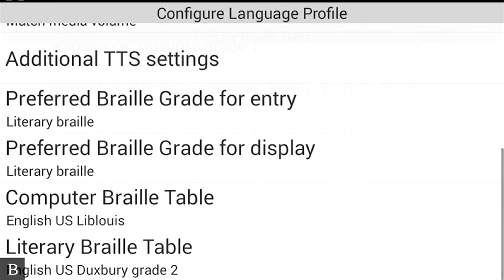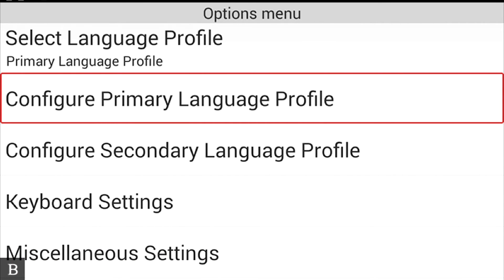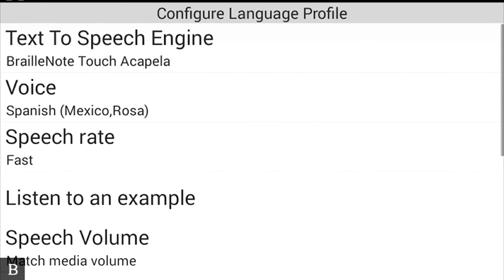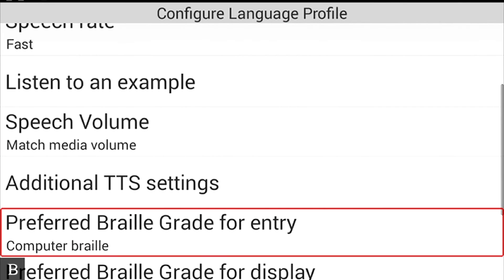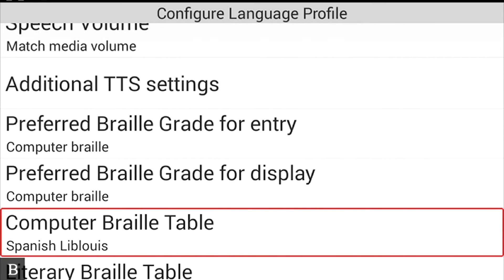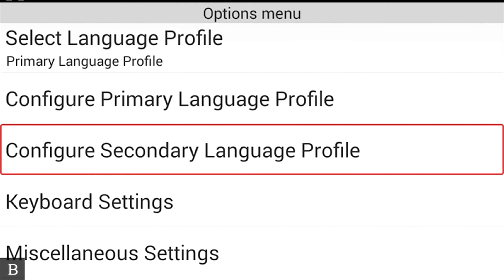That's the end of the primary language profile configuration. Pressing back and then next takes us to 'Configure Secondary Language Profile.' My secondary is already pre-configured to Spanish: voice is Spanish Mexico Rosa, the computer Braille table is Spanish Liblouis, and the literary Braille table is Spanish Duxbury Grade 2. With one key press I can toggle immediately to my Spanish configuration. We'll go through language switching in another video.